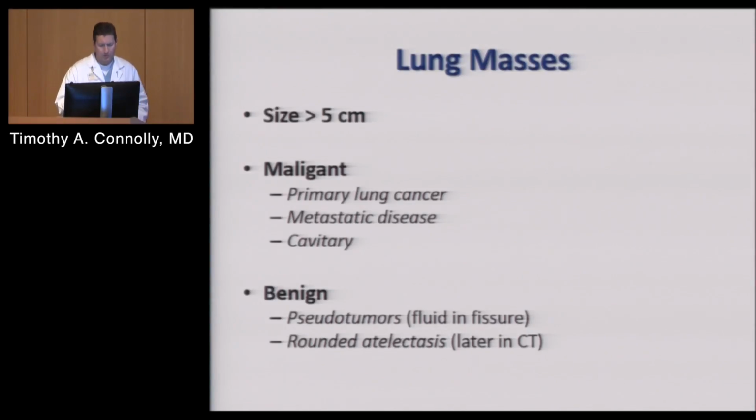But ultimately, when you've got a big enough mass and you're not sure what's going on, PET scan would be wonderful to order, and I think I've got a picture of a PET scan at the end. You can't do it inpatient, so that's an outpatient conversation. But that may indicate whether you need to aggressively go after it or not. Most of the time, we want tissue.